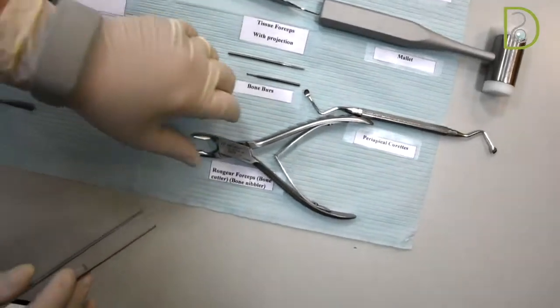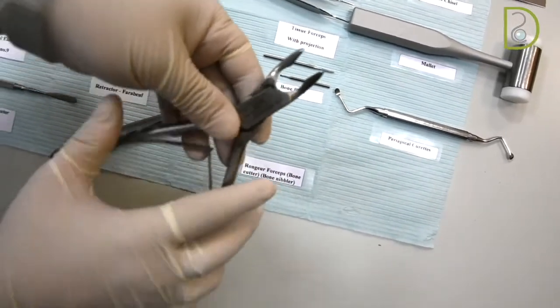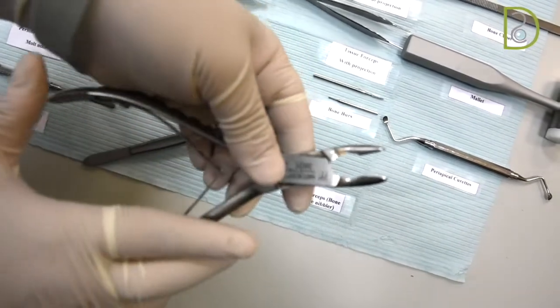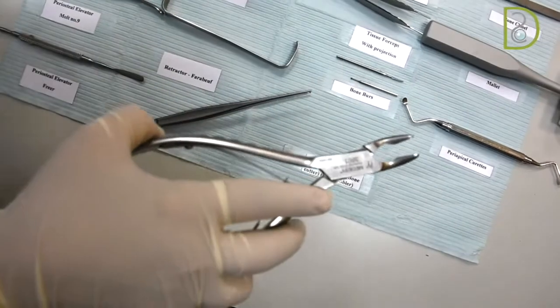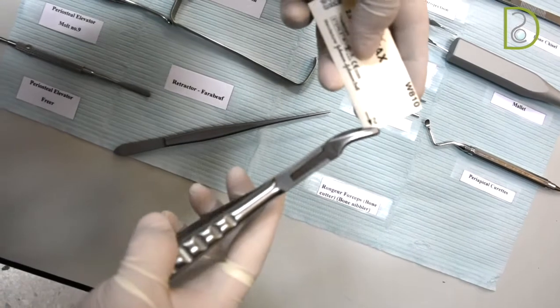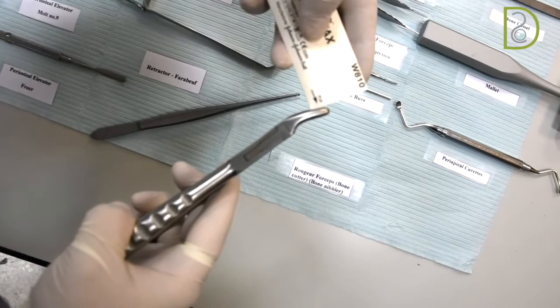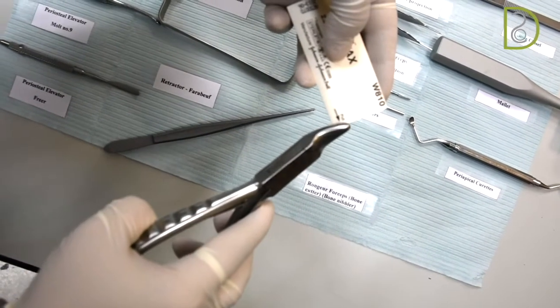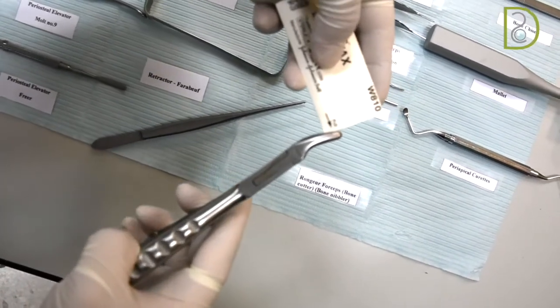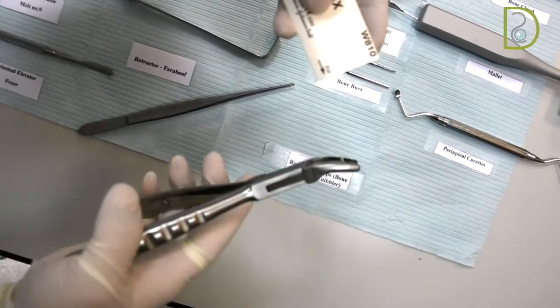Now we have the rongeur, and the rongeur either will be side cutting or side and end cutting, like this design. The way you will use it is like a nail clipper. That means I will come close to the bone. Let's assume that this is the bone. You will come close to it, and if I'm using it from the side, I will hold it in one position. I will not rotate the rongeur. This is forbidden. Just imagine it's a nail clipper. Then you will hold it in one place, and then you will press and pull away. That's it. As simple as that.